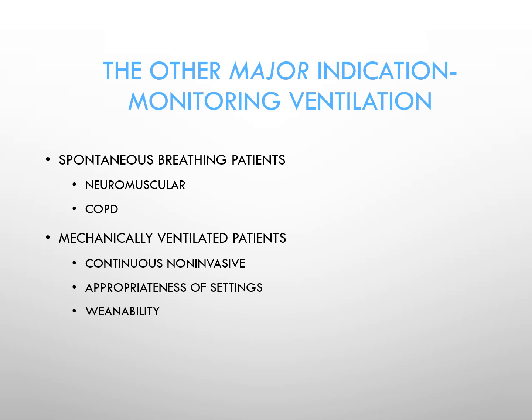There's a Dr. John Bach, who's at a university hospital in northern New Jersey. He does a lot of work with neuromuscular patients, and when they come into his office, he will invariably measure their end-tidal CO2. He has found that over a period of time, the increase in their end-tidal CO2 will correlate with the progression of their disease. So as their muscles get weaker, the CO2 will tend to build up and be able to be measured in the context of capnography.